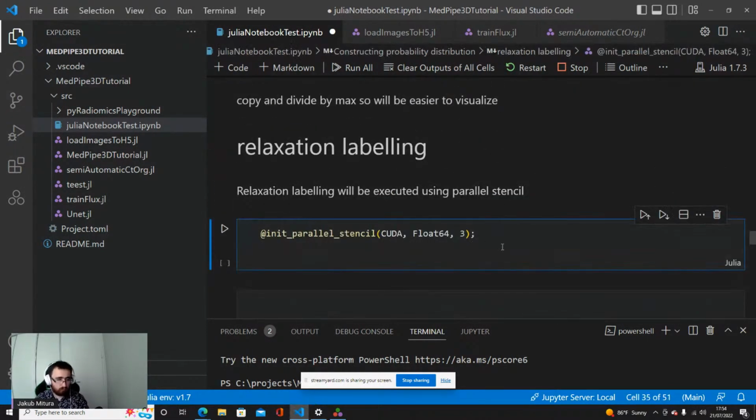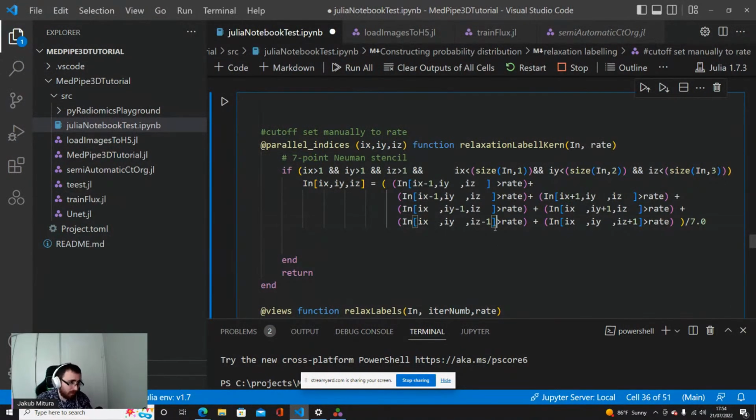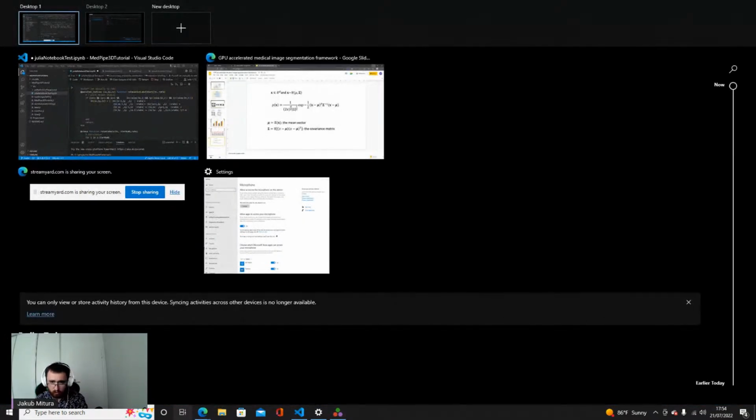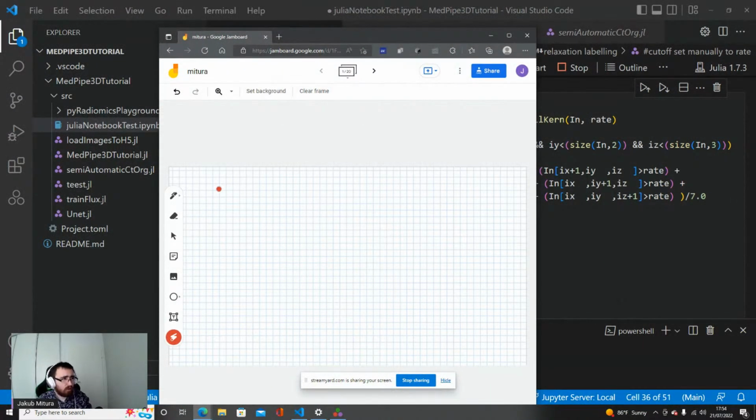This is to show you a lot of different tools, and this is, I suppose, the best tool available, maybe the best, but I'm a huge fan of the parallel stencil, basically. The parallel stencil is the library that enables you to get any stencil computation. As far as I know, this was created for the stencil computations for modeling of the glaciers or things like that, but it works extremely well in this medical imaging domain.